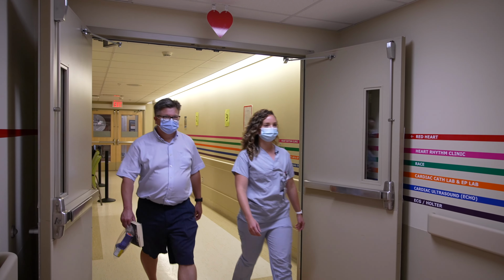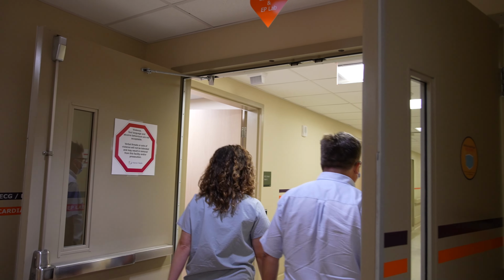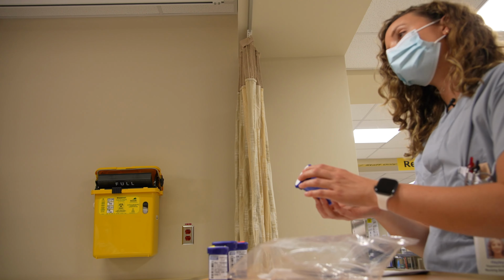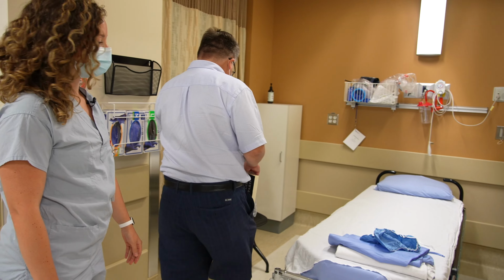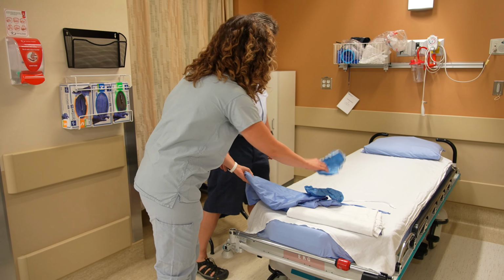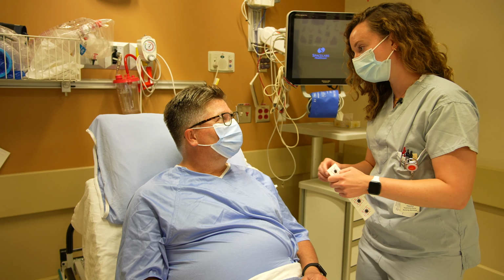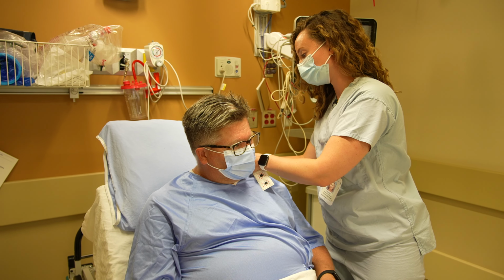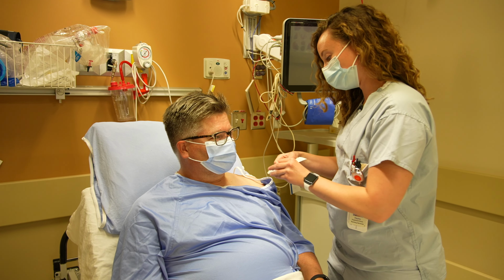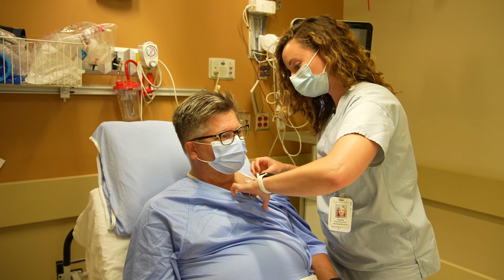Alternatively, if you're already waiting in the hospital for your procedure, the nurses looking after you will ensure you receive the proper medications and preparation for the procedure. Your nurse will let you know when it's your turn to come to the cath lab. You may bring a book or cell phone if you wish, but leave your other valuables behind, as you will be returning to your hospital room after the procedure is finished. Whether you are coming in from home or waiting in the hospital, once you arrive in the cath lab, your preparation will be the same.